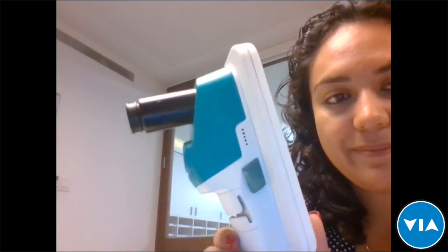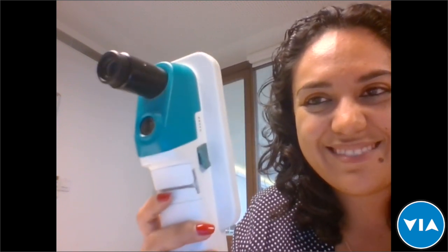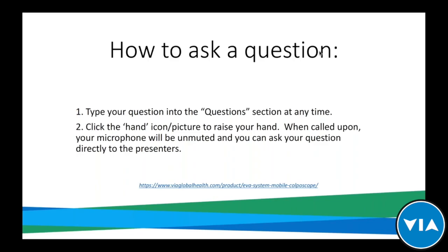Great. I think that satisfies most people's concerns about what it looks like. Thank you very much. And then there's just another quick question, I think you might have mentioned it, about the amount of time that the battery charge lasts once it's fully charged. Yes, it's 12 hours of continuous use. So that means if I turn on the light, it can stay on for 12 hours without being recharged. Now, in a clinical practice, you'll probably turn it on, leave it on for 30 seconds or a minute, turn it off for 30 minutes, and then turn it on for a couple minutes and turn it off. So it can last up to a week without being recharged.